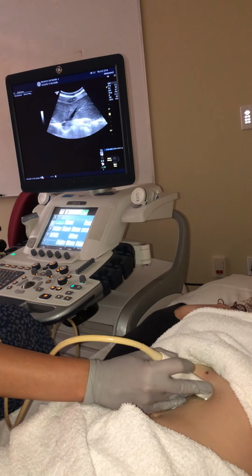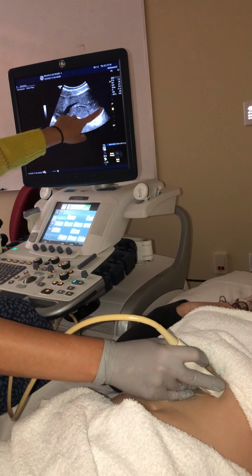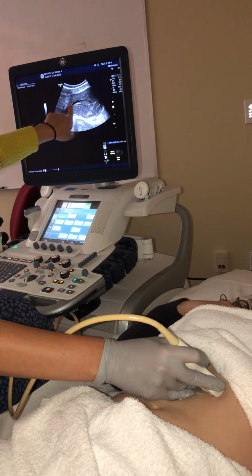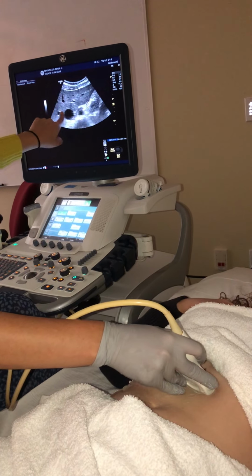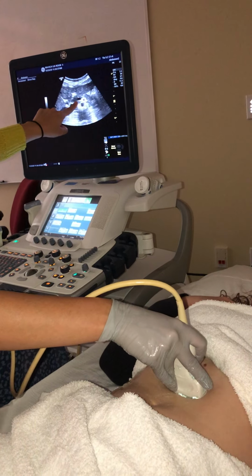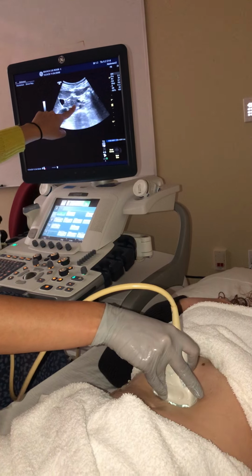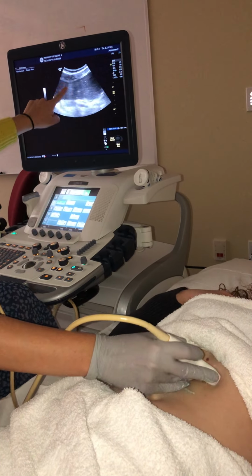We're going to sweep up underneath her ribs. We're looking at all of this left liver lobe tissue. We have a left hepatic coming in over here. We have our IVC here. Looking at this tissue. Sweeping down, getting into our pancreas because we know our pancreas sits posterior to the liver. So we're looking just at that tissue here.